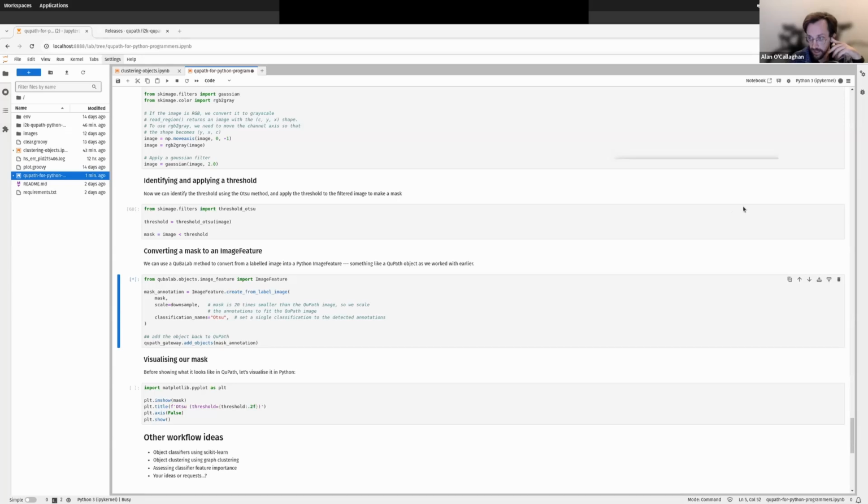Can this be used to train a U-Net in QuPath? I think in principle, yes. I won't be going through anything that complex just yet, but you could imagine setting up your annotations in QuPath and then reading those regions and supplying them to PyTorch for training.